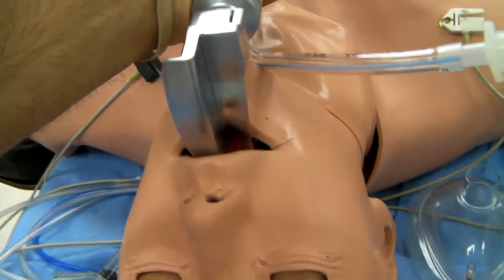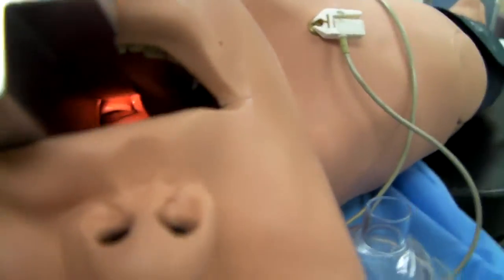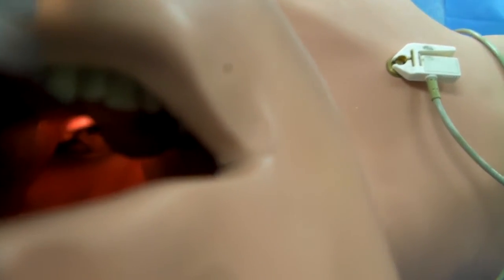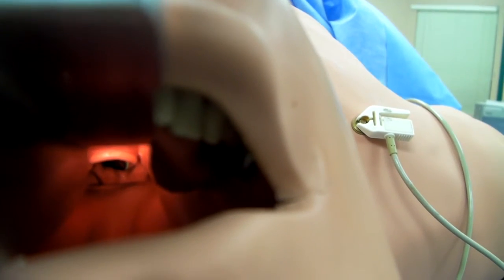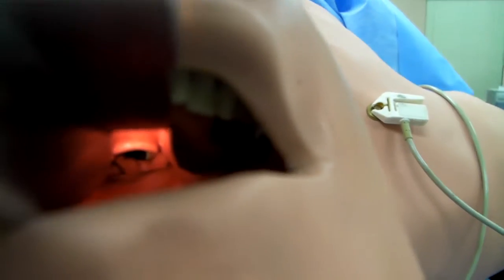This goes like this, and then you open them up, and I don't know if you can see the vocal cords. I would have to rip them apart, but, well, almost. Yeah, you can see the vocal cords. You see that white hole-like, cave-like thing? You can see it pretty well, but that's because he's missing upper teeth.